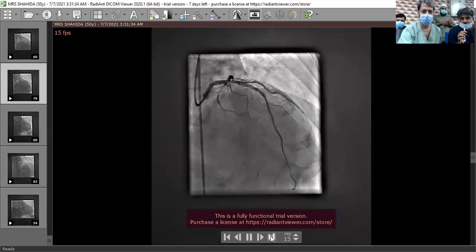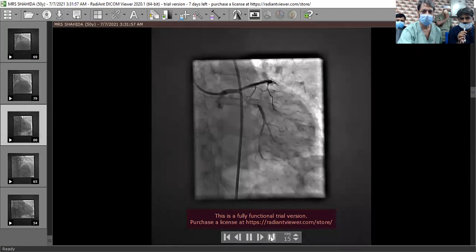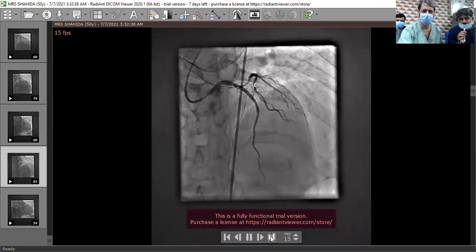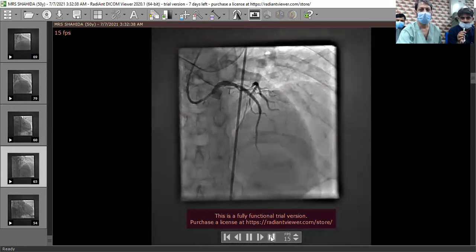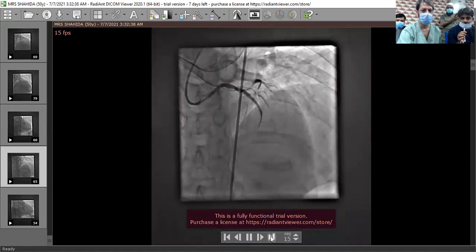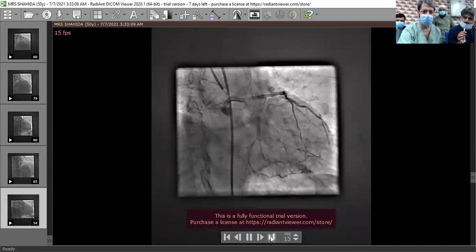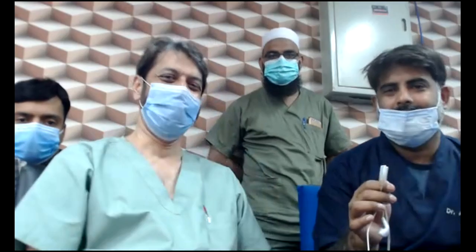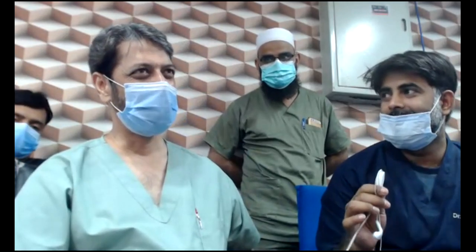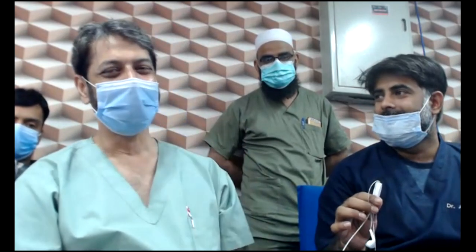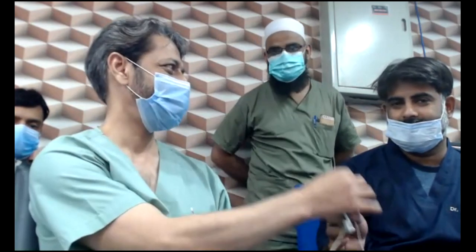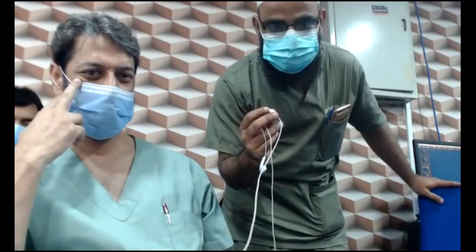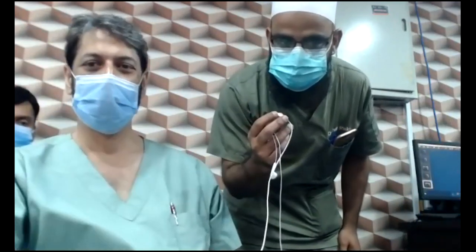There is good TIMI flow in the LAD. The diagonal has slightly restricted flow, but since it is an acute case, we have not gone for diagonal intervention — just maintained TIMI flow in LAD. The plan is staged PCI. A stent was placed in LAD, and the proximal segment could accommodate another stent.